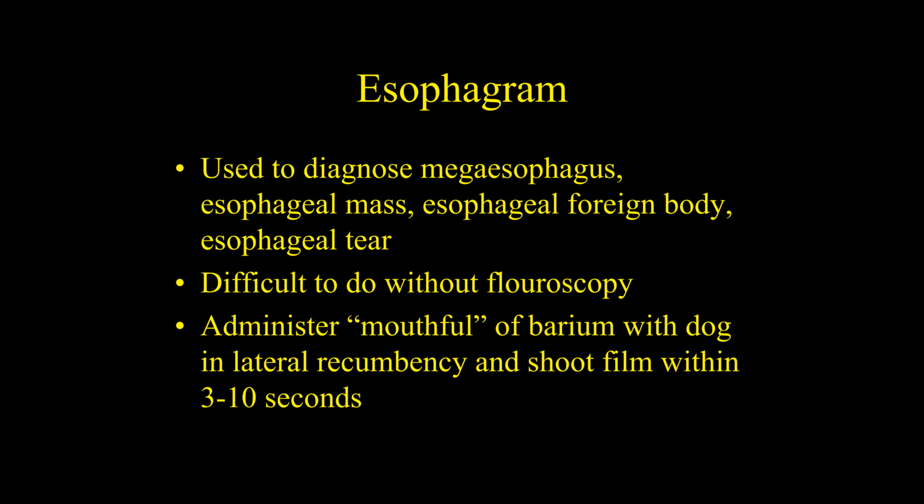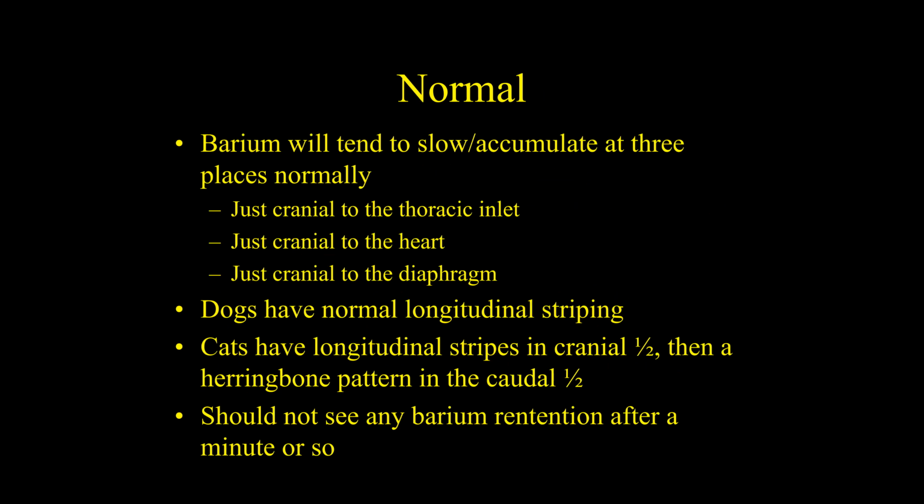Esophagrams, typically, if you go into a teaching institution or a university, they're going to do these with fluoroscopy, which is video X-ray. And so you can actually watch the contrast material move down the esophagus in real time on a computer monitor. Normally, when you give the barium contrast, the esophagus is nice and thin and smooth.